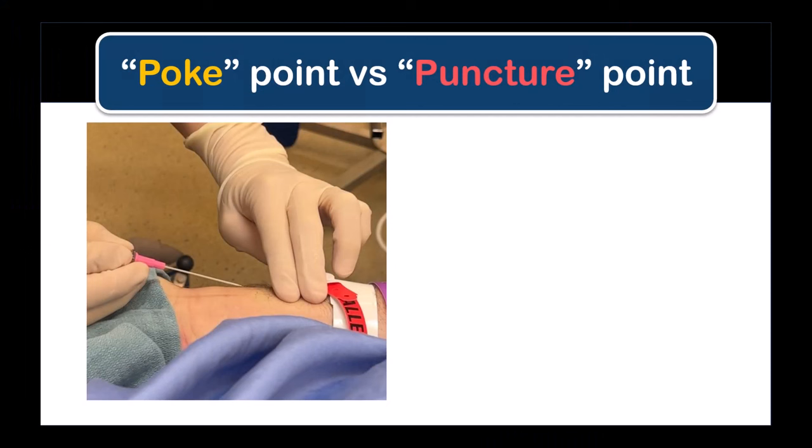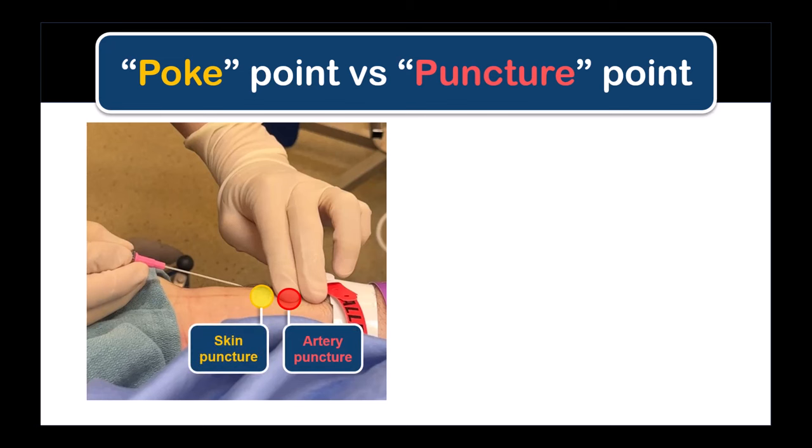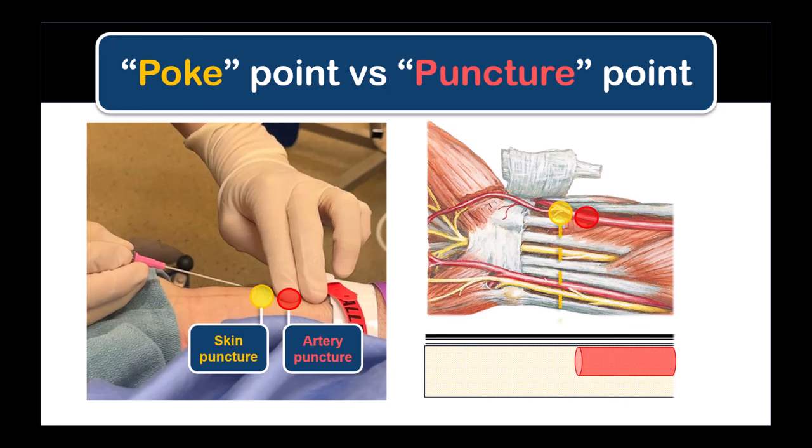Once you've located a good pulsation point at which to puncture the artery, puncture the skin one to two millimeters away from where you intend to pierce the artery. I always separate what I call the poke point, where I enter the skin, from the puncture point where I'm actually entering the vessel. This poke point should also be where you infiltrate local anesthetic in an awake patient, so as not to obliterate your ability to palpate the arterial pulse.